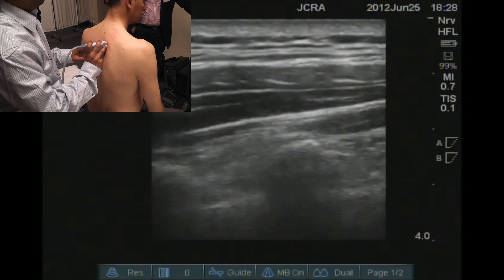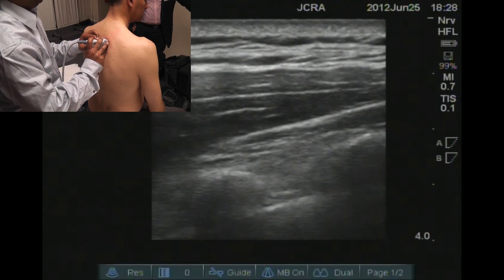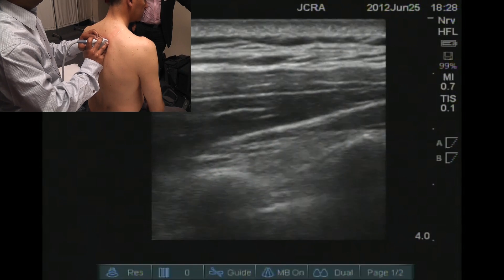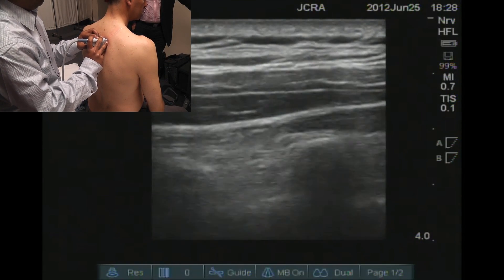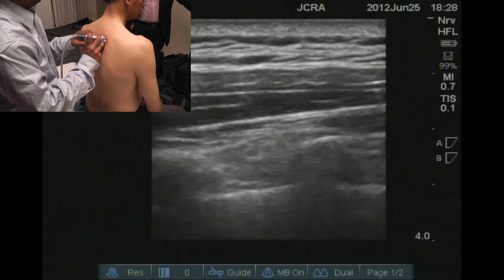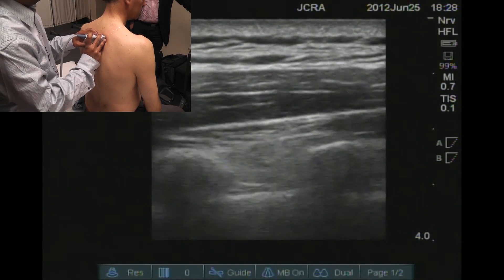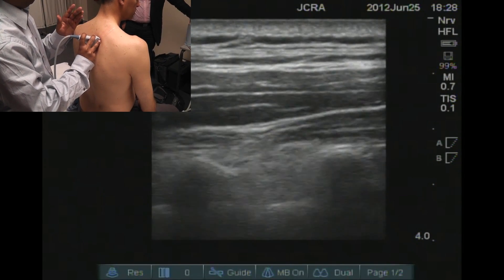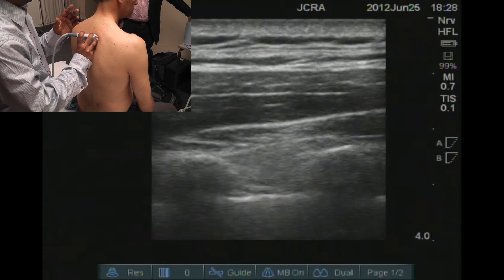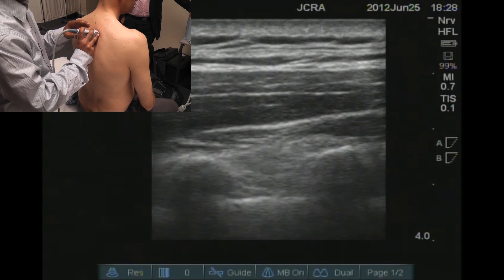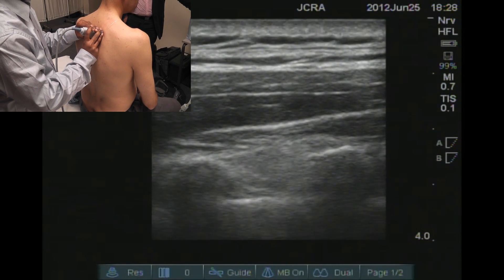The intercostal space is very easily seen with an ultrasound probe using a linear probe. You can see the rib as a curved white line with an acoustic shadow. And in between the two ribs you can see the intercostal space with the intercostal muscles. Sometimes you can see the pulsation of the intercostal vessels, and then beneath the intercostal muscles you straight away hit the parietal pleura.